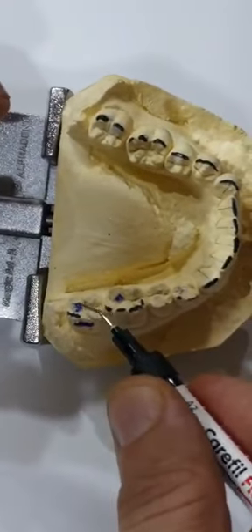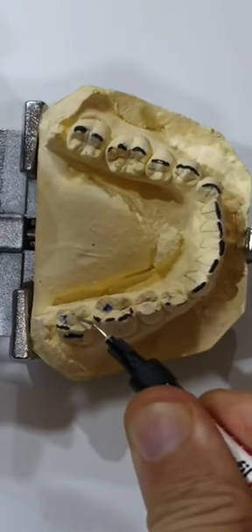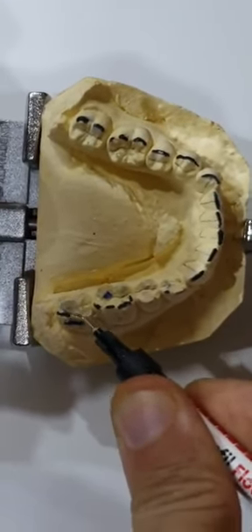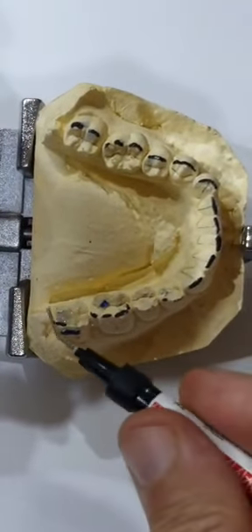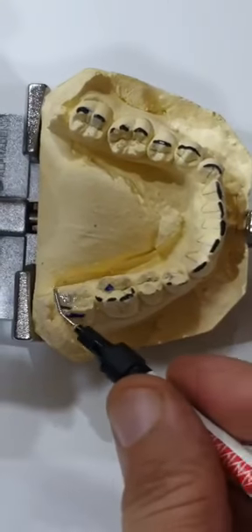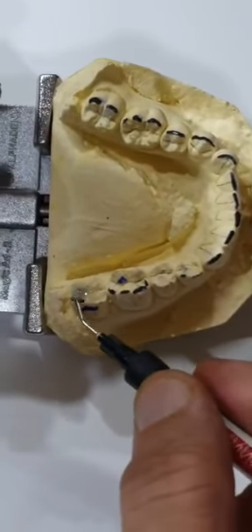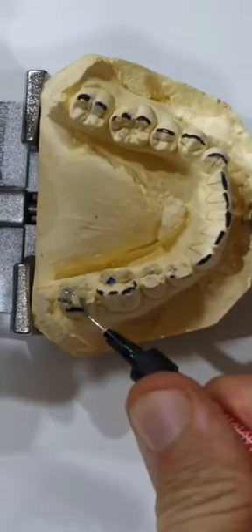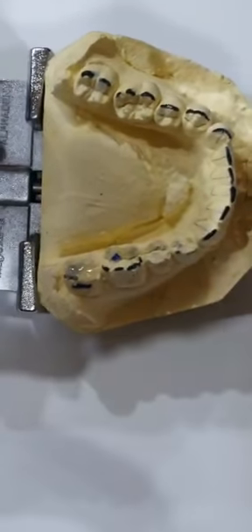Once we have etched and applied the adhesive in a spot or so, I would express my flowable or packable composite onto the occlusion and get it to whatever determination I want — which will be about a millimeter or so — and I would keep it nicely level. I'm filling up only the occlusion space between the two cusps: on the facial, lingual, mesial, as well as the distal.